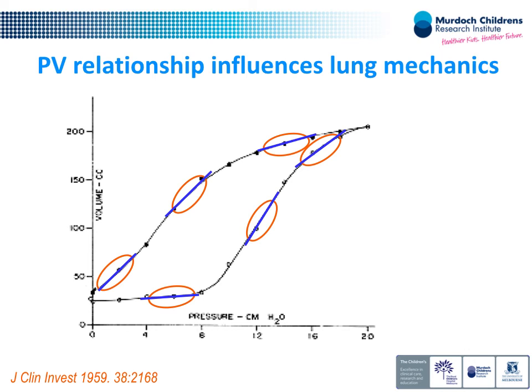This is now some data on PEEP trials on conventional. So in other words, one approach would have been in this baby to say that PEEP of 5 is simply not enough. Yep, I think you're absolutely right. We don't have good PEEP trials in modern ventilation strategies. I would love to do one. I just struggle to convince people in Australia that doing a PEEP trial is something we should do.